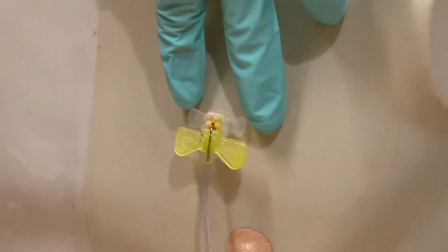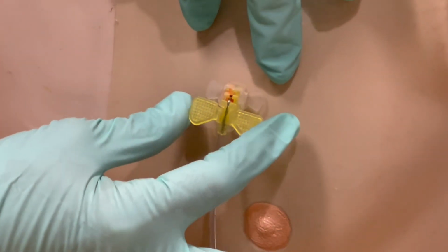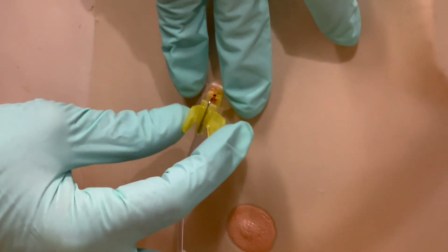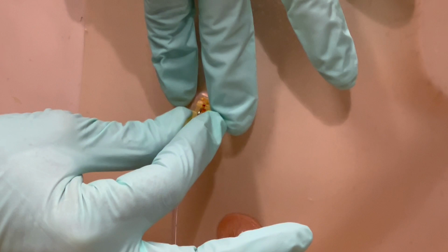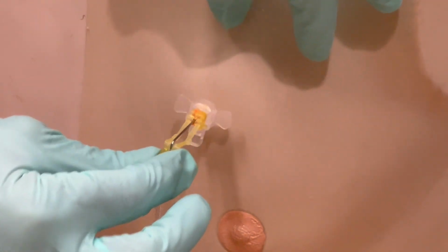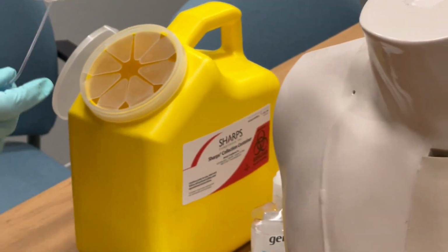Now you can see that there are two clear tabs against the chest and then these yellow wings. We're going to fold the yellow wings up and use one hand to push against the chest on the clear tabs. And with your other hand, you're going to take the folded yellow wings and pull straight out. 1, 2, 3. When you hear a click, you'll know that the needle is removed from the port. This goes right into the sharps bucket.